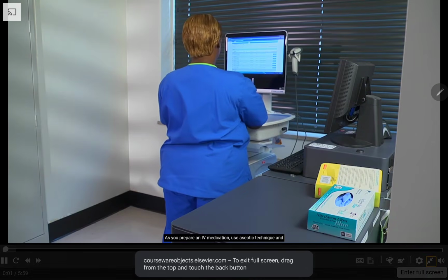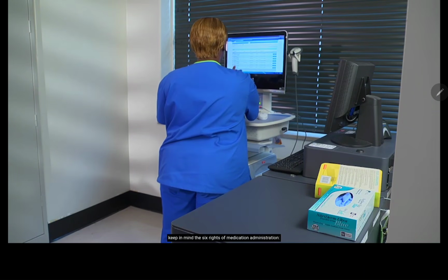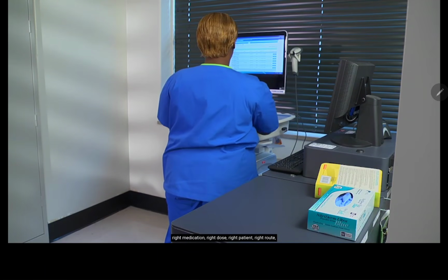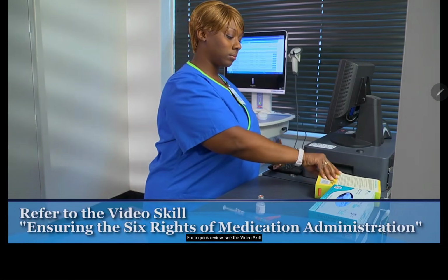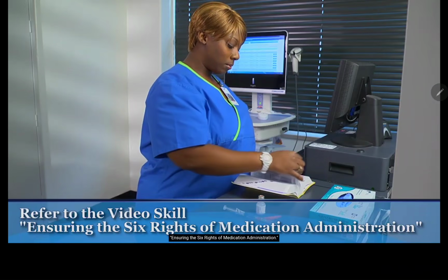As you prepare an IV medication, use aseptic technique and keep in mind the 6 rights of medication administration. Right medication, right dose, right patient, right route, right time, and right documentation. For a quick review, see the video skill Ensuring the 6 Rights of Medication Administration.